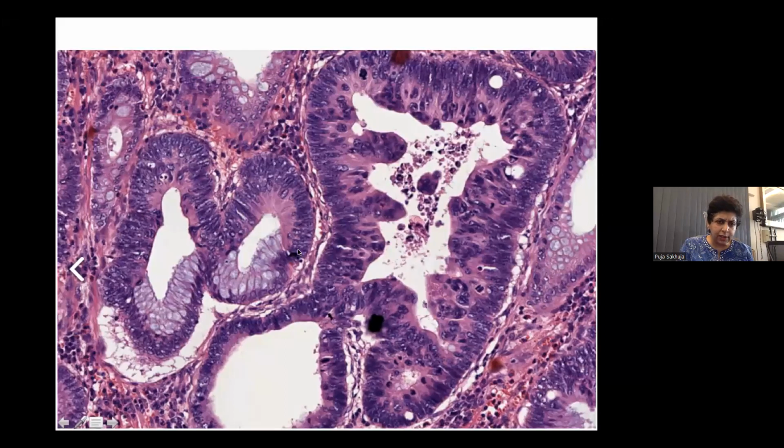So if we see just this type of dysplasia, where the goblet cells are no longer present, the nuclei are elongated, they have a higher NC ratio, these cells are crowded, overlapping, with pseudostratification, but just this much as in the one that I am circling with my pointer, then this could just be low-grade dysplasia. But the moment you see a lot of these nuclei reaching the surface of the lumen, and these little papillary projections within the lumen, presence of necrosis, this is now high-grade dysplasia or even an in situ carcinoma, and the implications of both are very different.